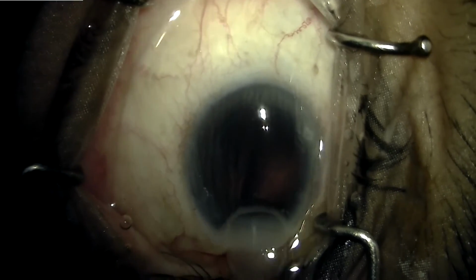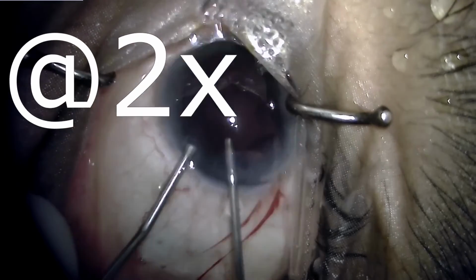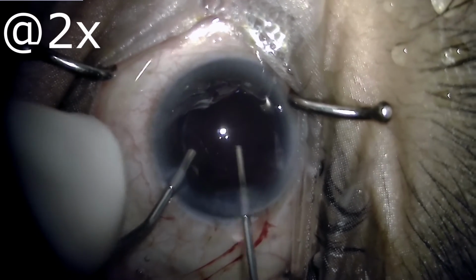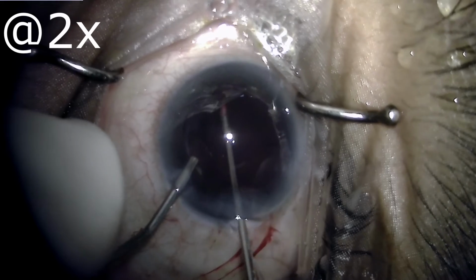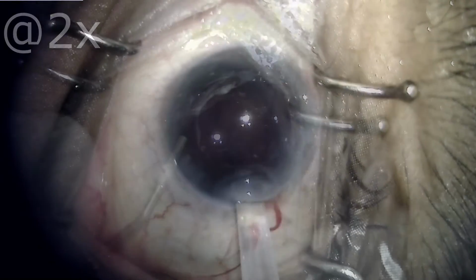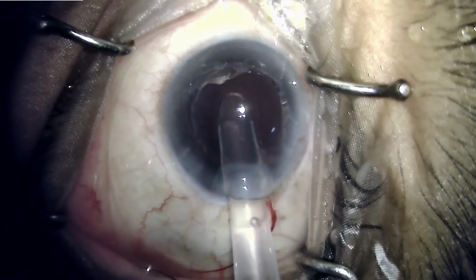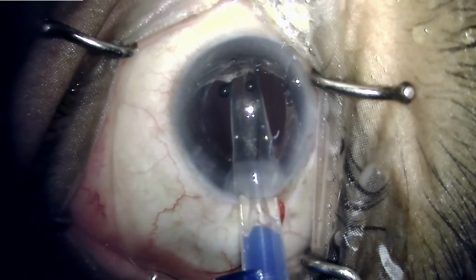The IOL was totally calcified, and then we proceeded with anterior vitrectomy because there was a YAG laser opening through which some vitreous had prolapsed out. Once the vitreous was cleared, a hydrophobic monofocal IOL was implanted in the sulcus, as we can see in the proceeding.